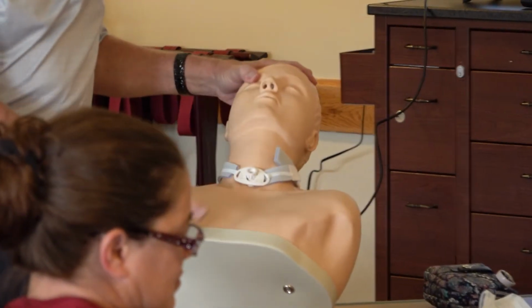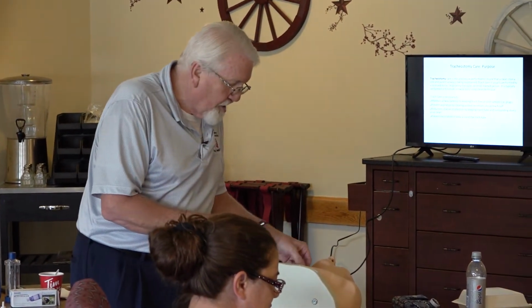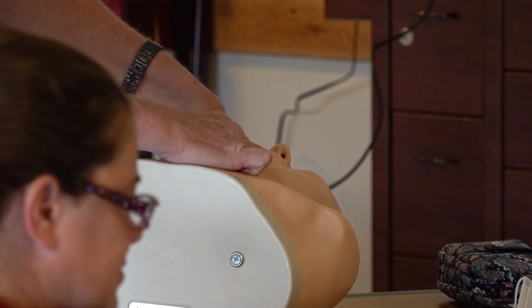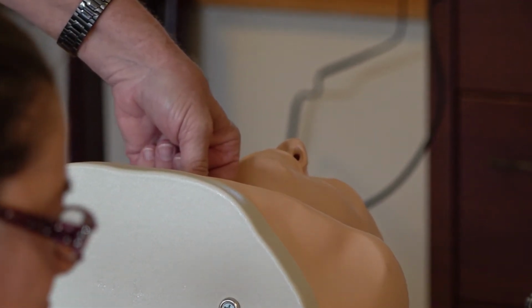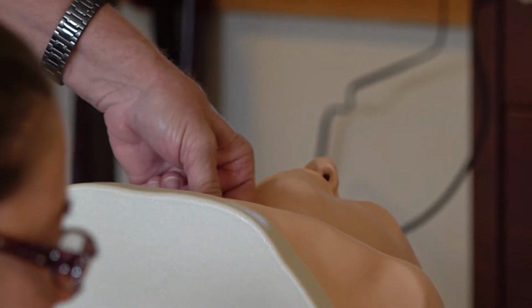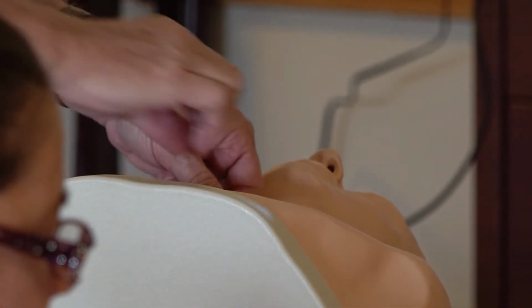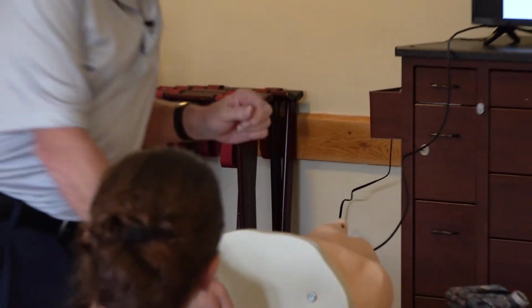So I've gotten the gauze out, and now I'm going to clean around the stoma. Like I said, I use 4 Q-tip swabs. I've moistened them with sterile water, and I'm going to secure the flange. And then I'm going to start with the one corner of the pie, and you always move away from the stoma with your Q-tip swab. Contact away, because you don't want anything migrating back into the airway through the stoma. Okay, so I'm going to do that 4 times, all 4 corners, and throw it away.